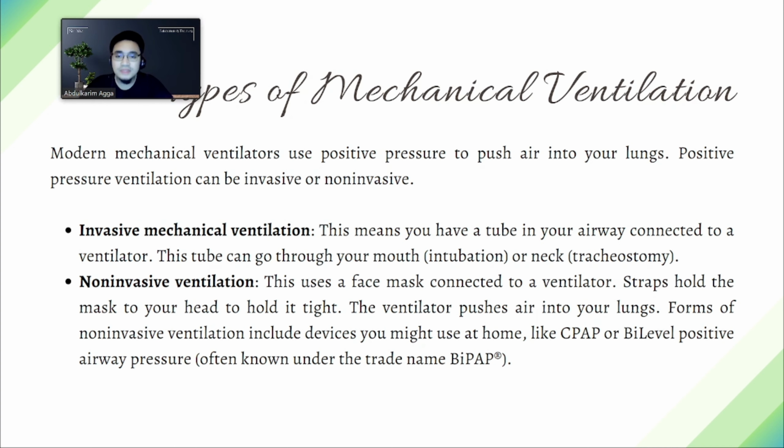Modern mechanical ventilators use positive pressure to push air into your lungs. Take note, modern mechanical ventilators use positive pressure to push air into your lungs. Positive pressure ventilation can be invasive or non-invasive by nature. Again, you need to remember this one. When BNS or when HMC would ask you during visits, positive pressure ventilation can be invasive or non-invasive.